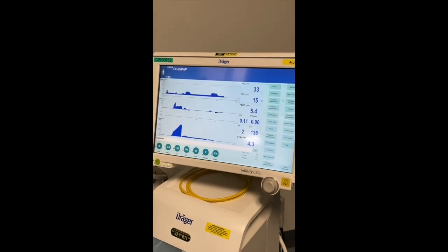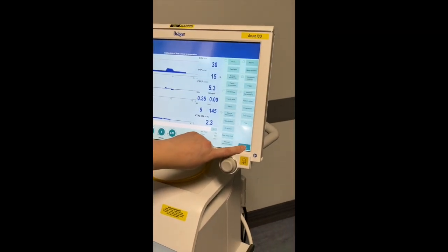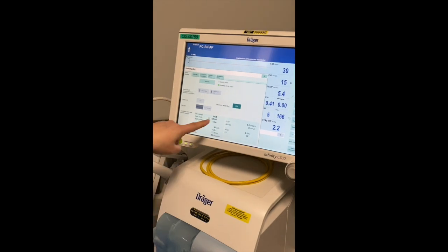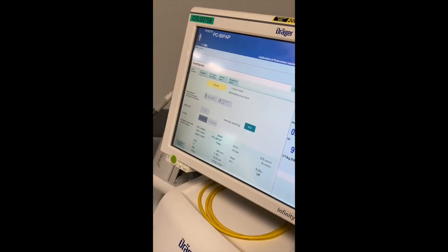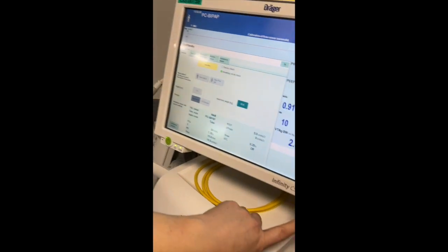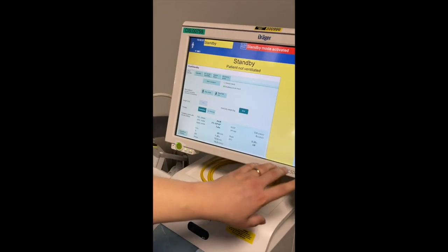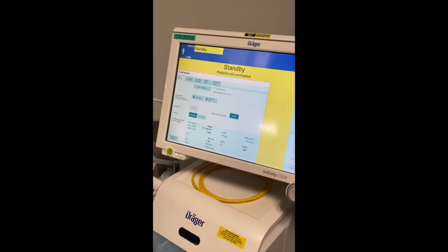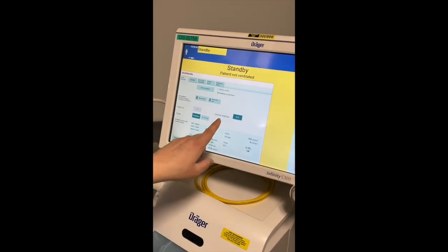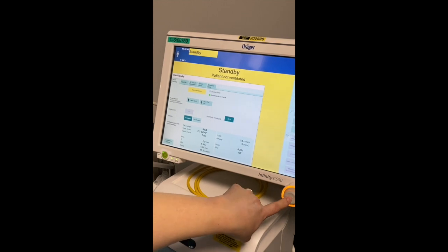If you want to put the machine on standby for any reason, press the standby button in the bottom corner and it will bring up your standby screen. Press standby and confirm with the rotary knob. Reset your alarm and confirm it again — it's now on standby. If you want to start it again, press start ventilation and confirm with the rotary knob.